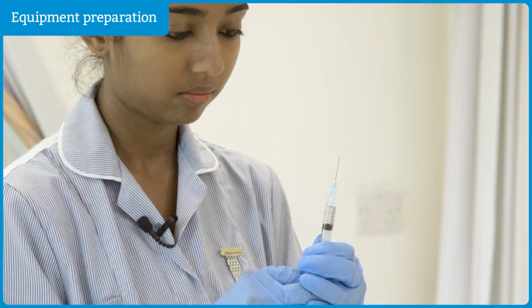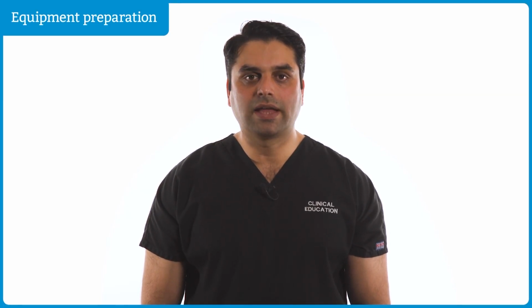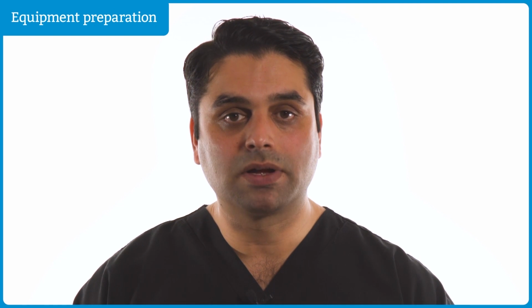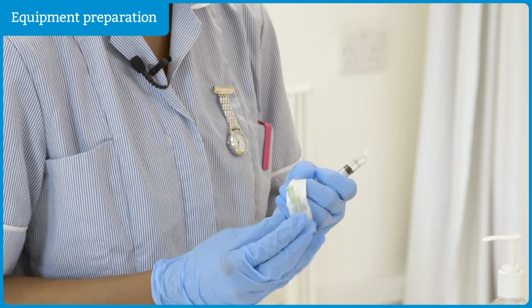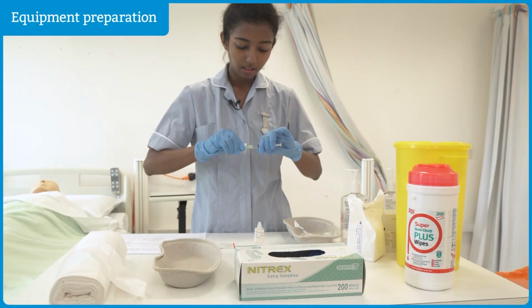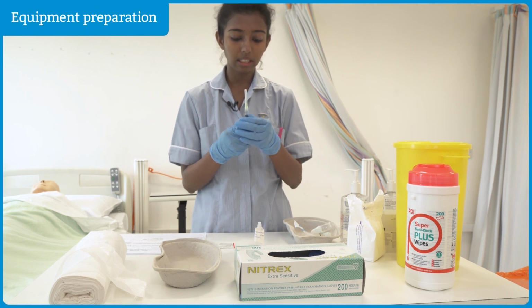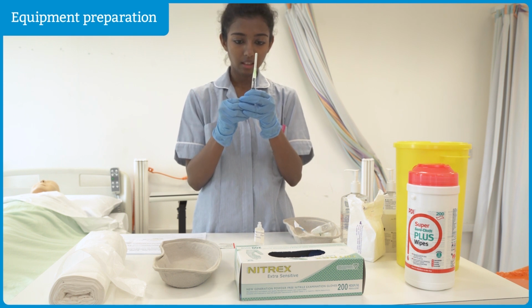syringe. Change the needle using either the scoop or direct removal technique, and again check the dosage in the syringe is correct. Dispose of all sharps safely in a designated sharp container. And now I put in the next needle by ensuring that I do not touch any parts. So this is the administration needle, and I again ensure that the correct amount of dose is inside the syringe.